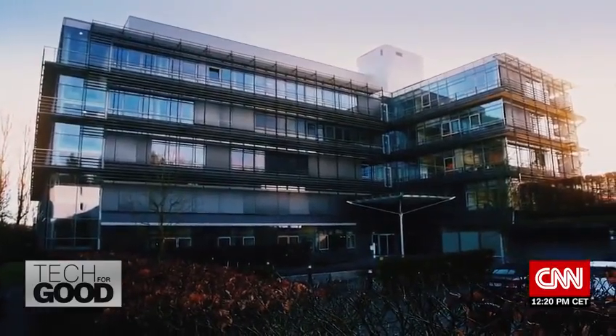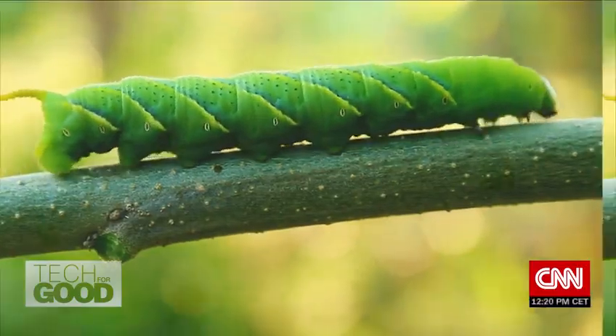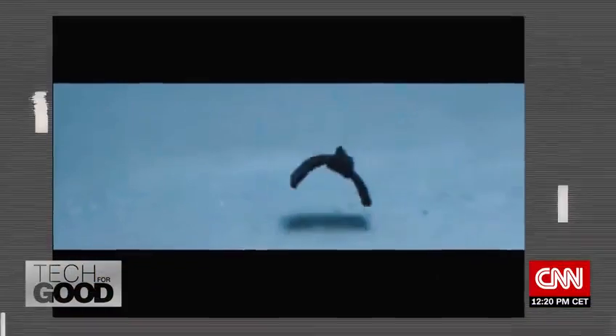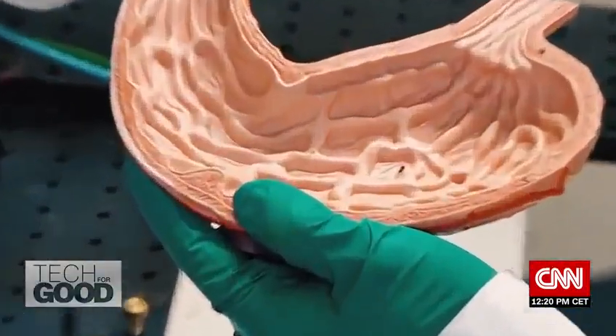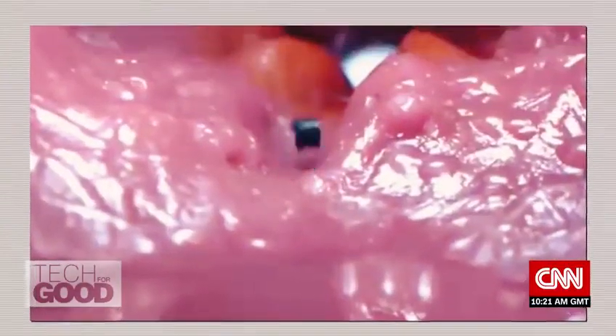At the Max Planck Institute for Intelligent Systems in Stuttgart, Germany, scientists are working on another millirobotic design modeled after the movements of a caterpillar among other organisms. In addition to drug delivery, the hope is to someday have the four-millimeter robot perform biopsies and replace the need for invasive surgeries.